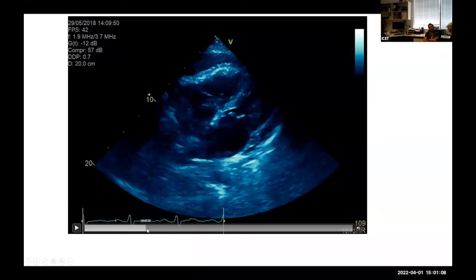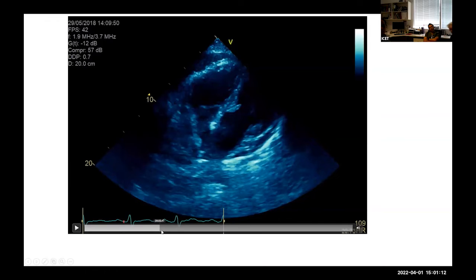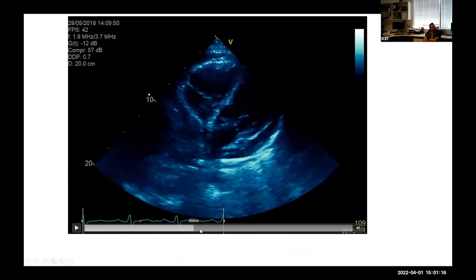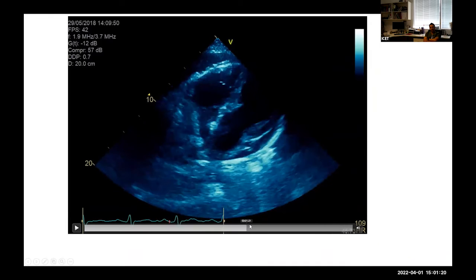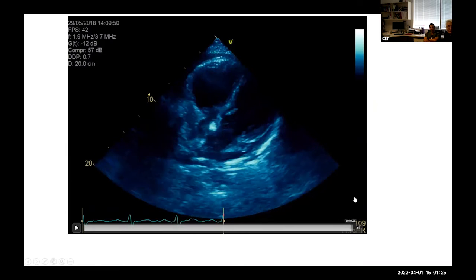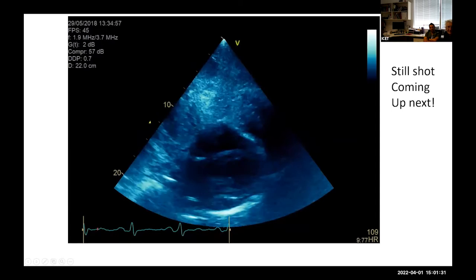Like the sort of diastole. Is this person sick or what? Tachycardic, I think, at least what we got, 109. It's doing a little worm. Yeah. Okay, so moving on.